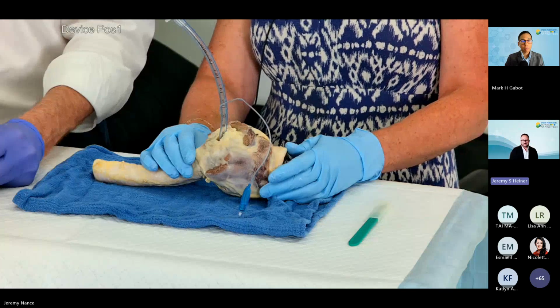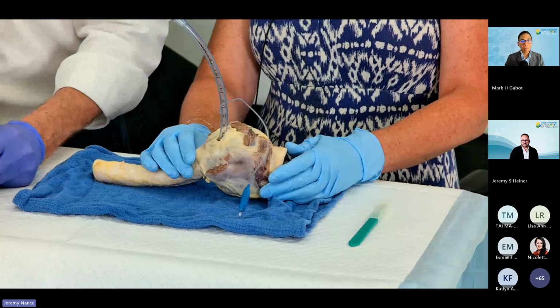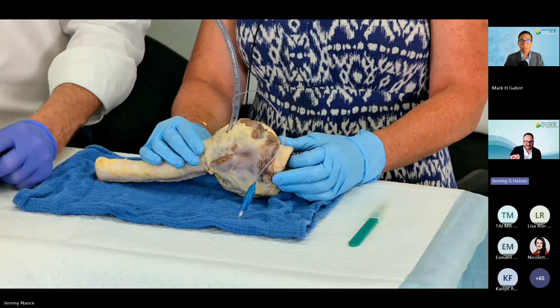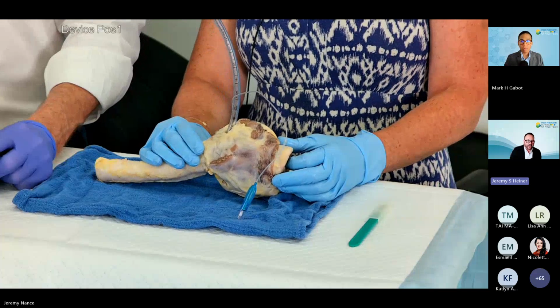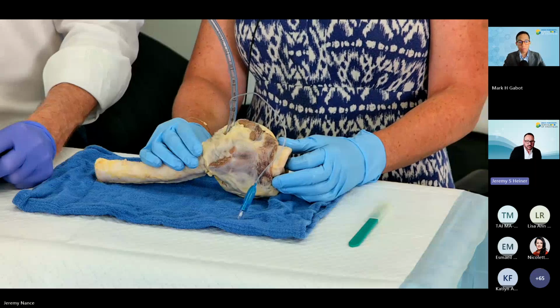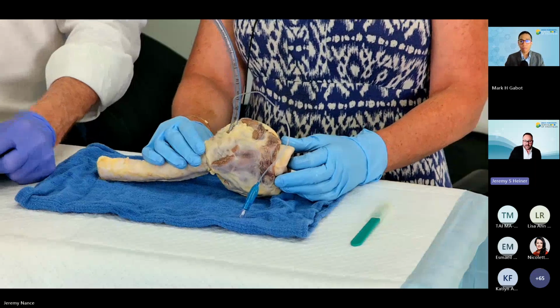Okay, and just to clarify, you do like the vertical incision first, just to get down to the membrane itself. I like the vertical incision if I have not already identified exactly the spot I'm going to go, and if I'm having any trouble identifying the cricothyroid membrane.